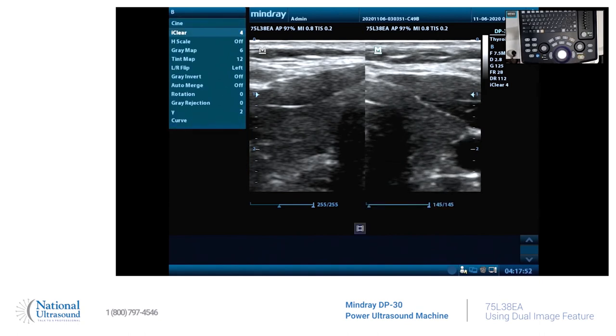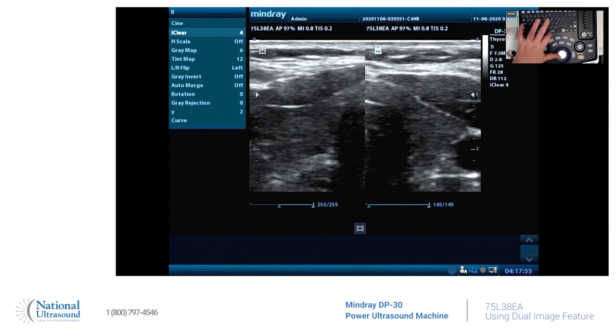To annotate, just hit the space bar and it'll let you annotate. You can freehand it, or you can go up here and select 'right.' You can select it again and move it. There's right. Let's select the left, highlight it, move it over. And what organ are we looking at? The thyroid. And there's how you use dual screen to show a thyroid that will not fit on one screen and will not fit in the field of view even when you use the extended field of view.